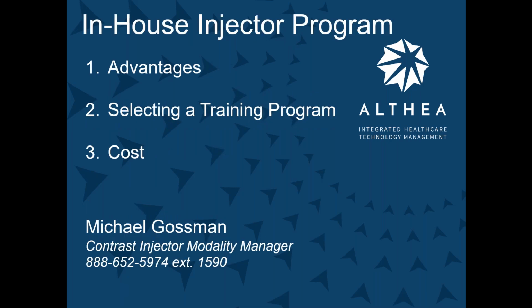In-house injector program. Who has an in-house injector program at their hospital, clinic, or sites? You must, right? Okay. What are some of the advantages of it? Go back one more step. You said less downtime. Why? Exactly. You're there. I have a problem in cath lab 4. I need you now. Those are the phone calls you get, right? Okay. You're there in 10 seconds.